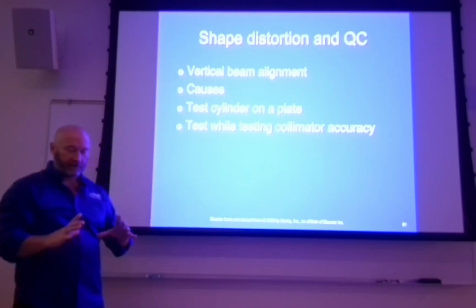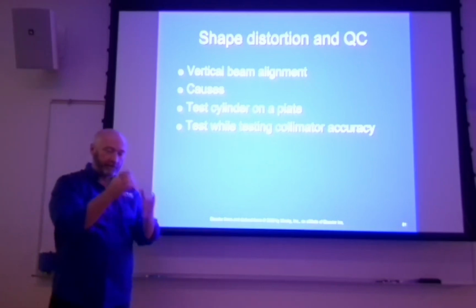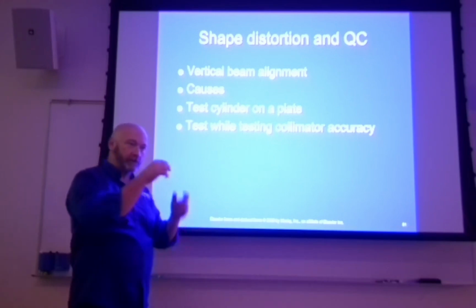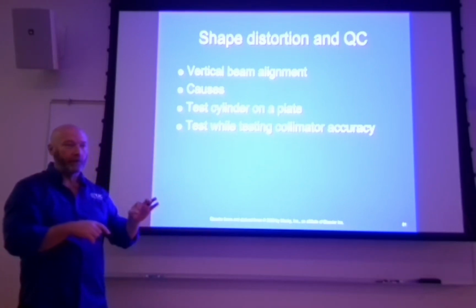And what you have is a template that you put the cylinder on top of, and you make an x-ray of it. You center directly on that top hole. And ideally, the two should be projected directly on top of each other. That template, though, has a couple of little circles on it that are radiopaque.